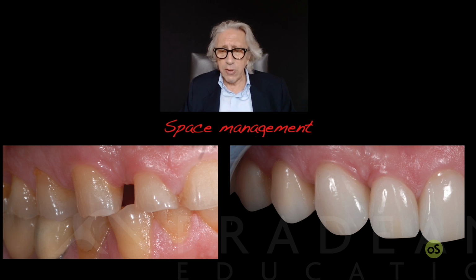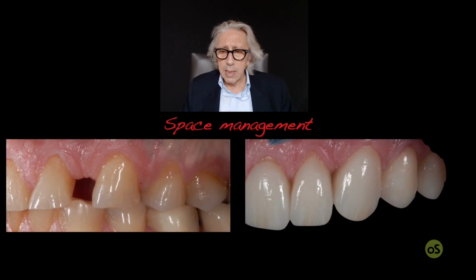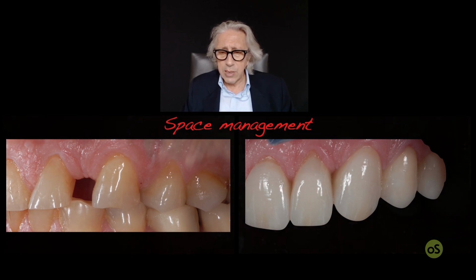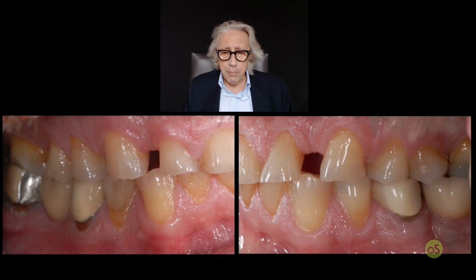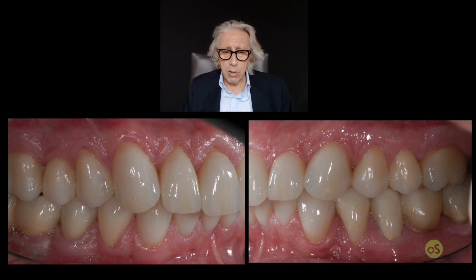If you see, there is no inflammation, no irritation at all, upper, right, and left. We moved, of course, the long axis of the cuspid and the lateral and the central in order to be able to really match the situation. Beginning situation, lateral view, a final situation of the diastemas that were completely closed.